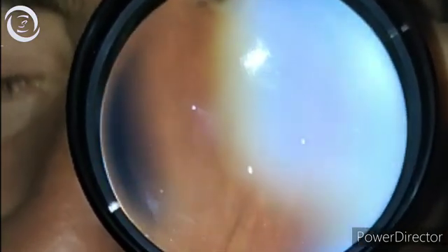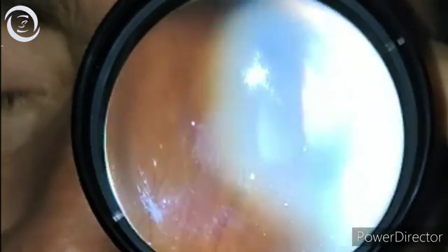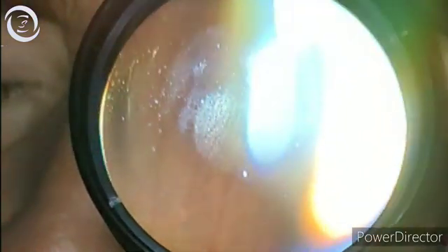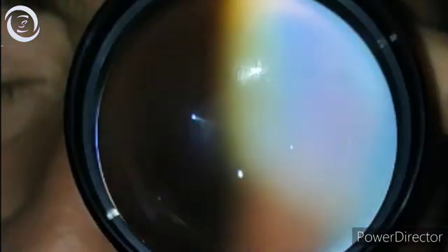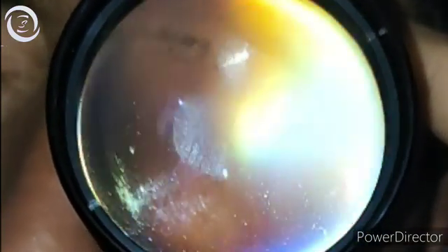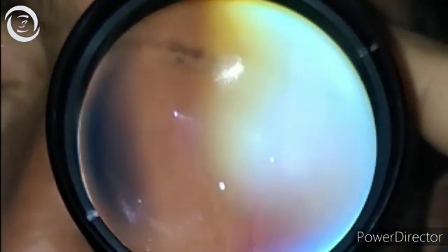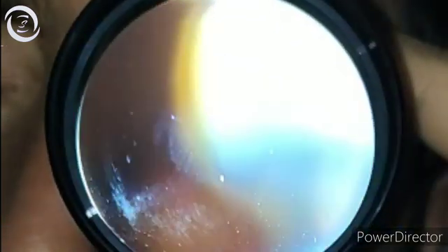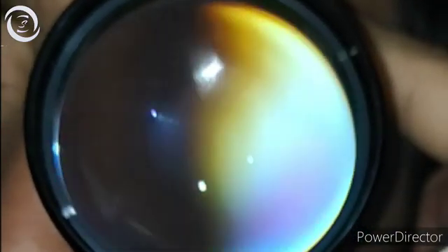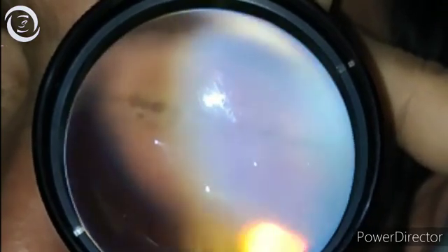You can clearly see here — if you look superiorly, there is a pigmented patch of lattice in this video, very clearly shown. I have worked a lot here to demonstrate that. That horizontal patch is lattice.